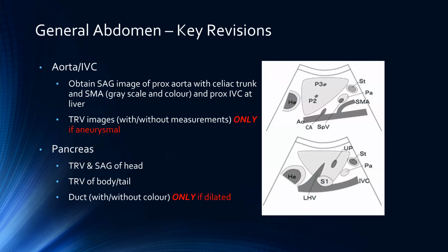So before we get into the details of the protocols, I just want to say that much of this is really just a review for most, and in general terms, a lot of what we are going to go over is already being done and being done well. That being said, I think reviewing the revised protocols in detail can go a long way in terms of ensuring consistency in the way we image cases across all three sites, and making us more efficient by clarifying what images need not be obtained for any given study.